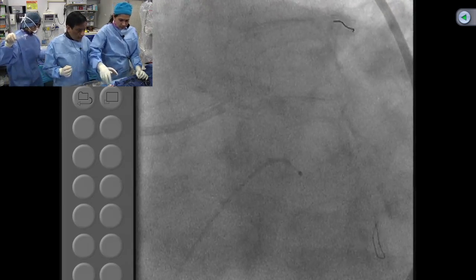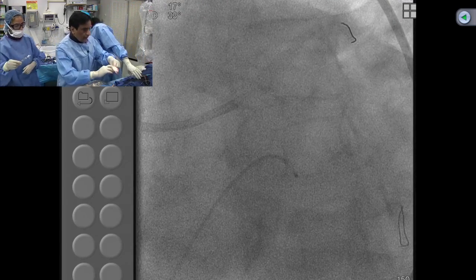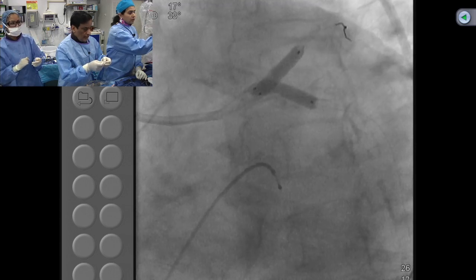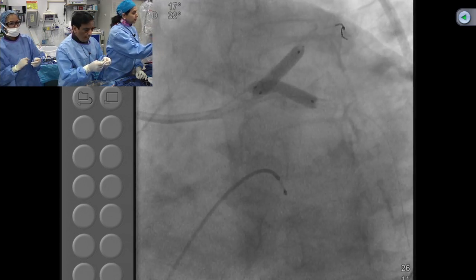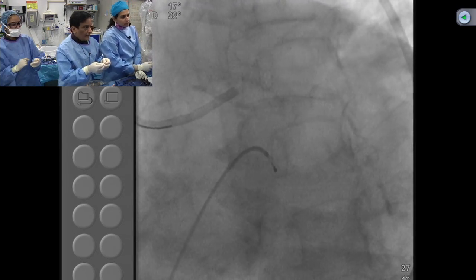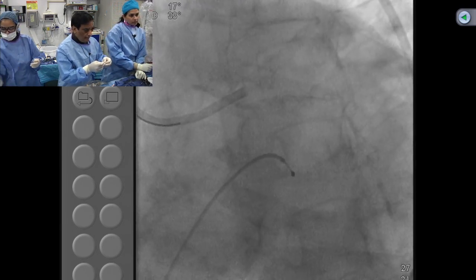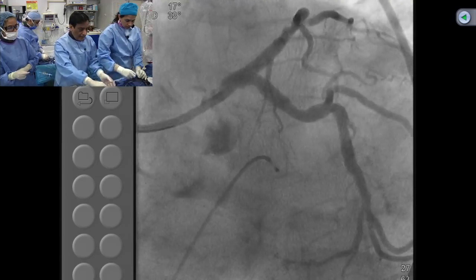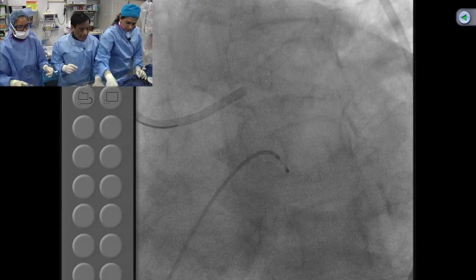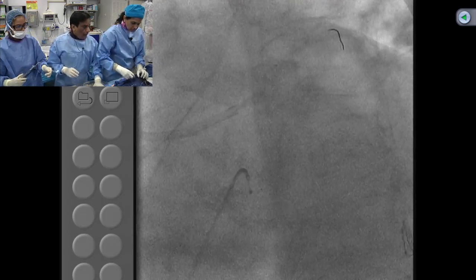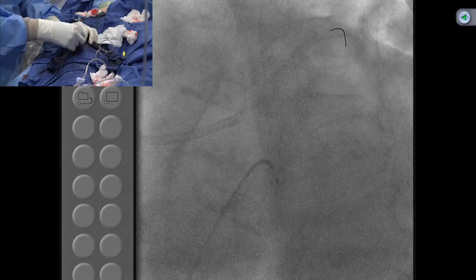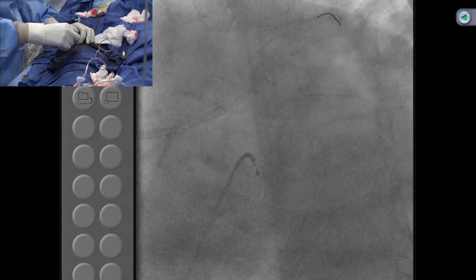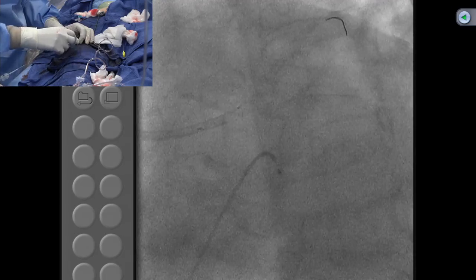Going back to the circumflex — there is still a little issue at the inferior part of the ostium. The circumflex is always the problem — restenosis and incomplete expansion at the ostial circumflex. We will use a 4.5 high-pressure non-compliant balloon into the circumflex and a 4.0 into the LAD within the bifurcation carina. We need to make sure the wire has gone through to the right lumen and not through the struts. We had a run-through in the circumflex before; now I have the Fielder. This is the 4.0 in the LAD.